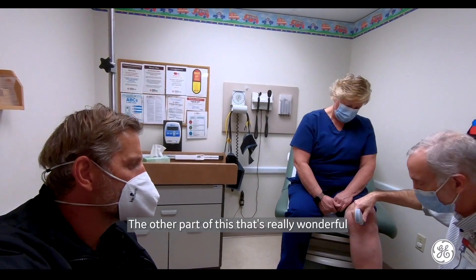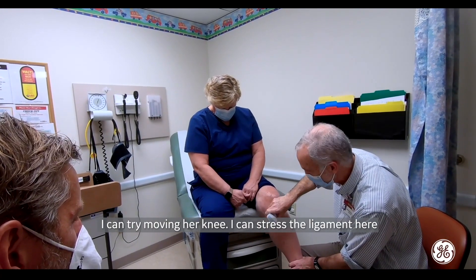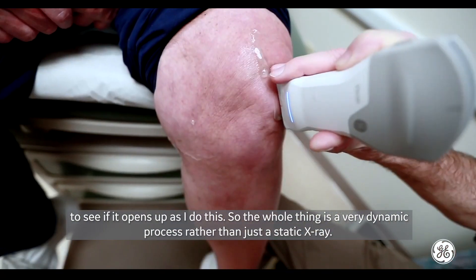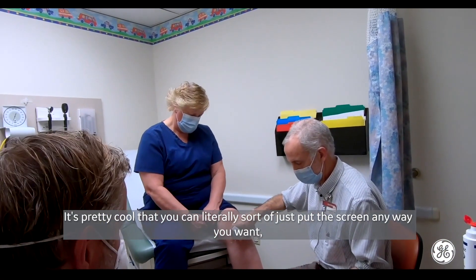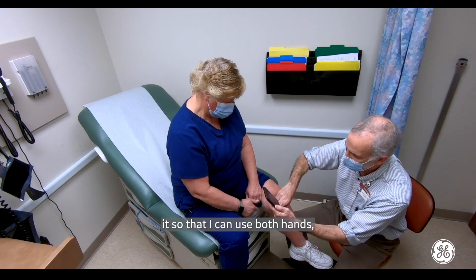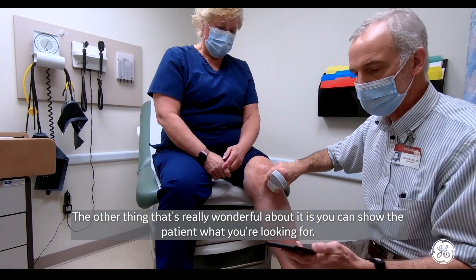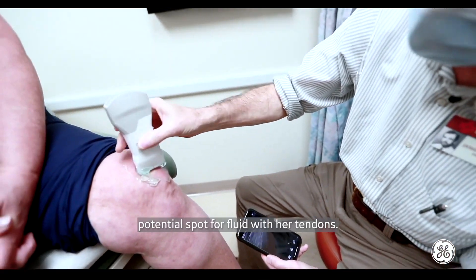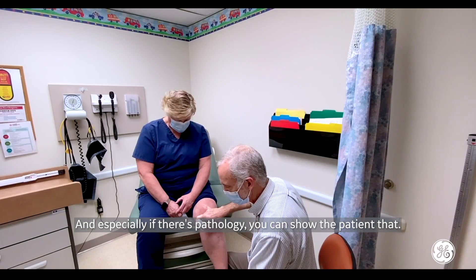The other part of this that's really wonderful is that you can use this dynamically. I can try moving her knee; I can stress the ligament here to see if it opens up as I do this. So the whole thing is a very dynamic process rather than just a static x-ray. It's pretty cool that you can literally put the screen anywhere you want based on the convenience for the exam. I've even had times when I've had the patient hold it so that I can use both hands to do a maneuver. You can also show the patient what you're looking for — we are showing Donna her kneecap, the potential spot for fluid with her tendons, and especially if there's pathology, you can show the patient that.